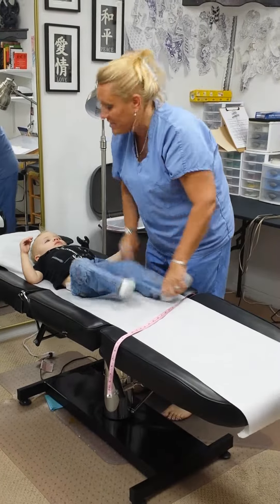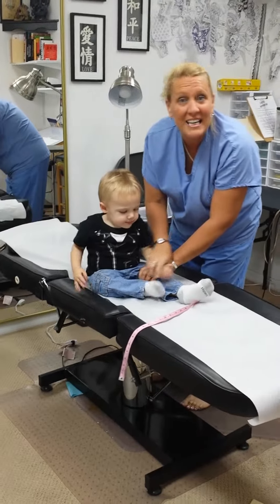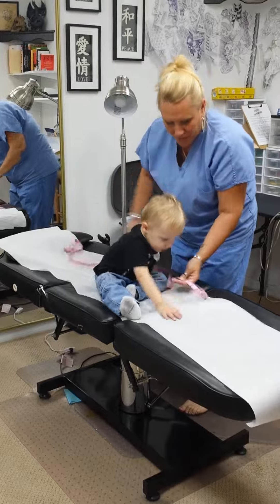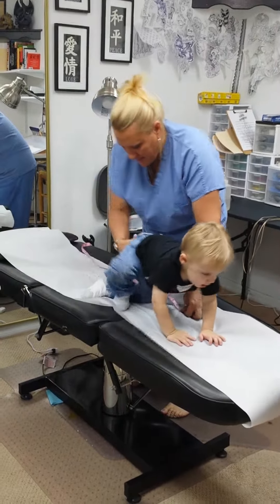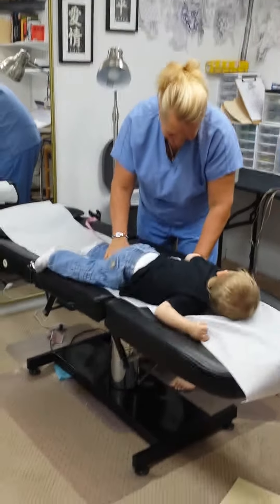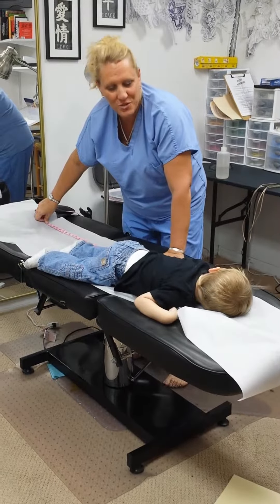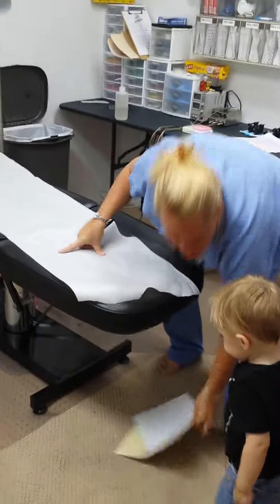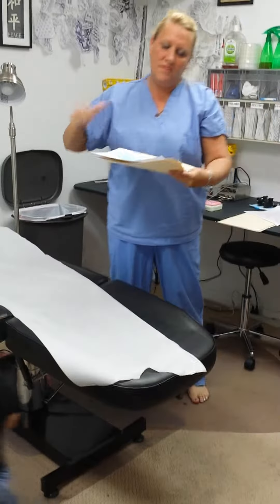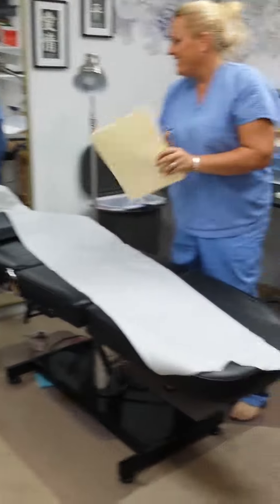At this age, it's sometimes easier to use the wall and sometimes it's not easy anyway. I'm going to measure from my mark to my top mark in inches. I can see that Richie is 32 inches. So I'm going to make sure the child is safely secured, and make sure that I have recorded on my chart and mapped just how tall he is. Thank you.